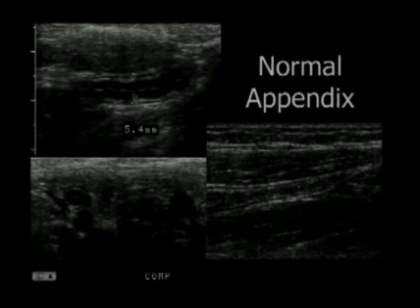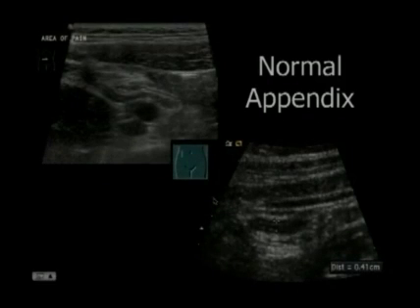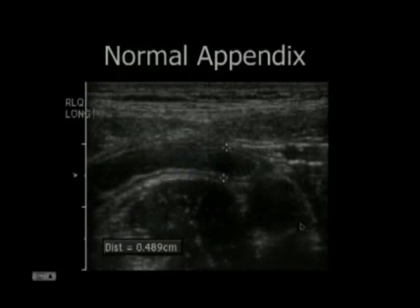Here's the same patient on a longitudinal scan, nice normal appendix. You see the tip well, there's no surrounding hyperemia, normal gut signature. In this case, again, here's a normal appendix. You see the blind ending tip. No hyperemia, no surrounding inflammatory change, normal size. Here's another case, nice normal appendix sitting on top of the iliac vessels here. Another normal appendix, slightly older case. Again, no surrounding inflammatory reaction.